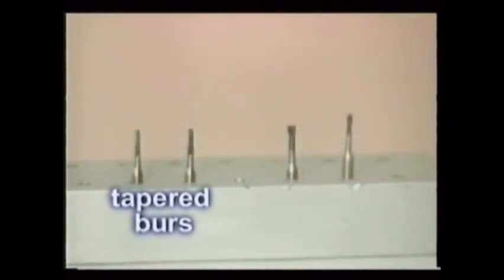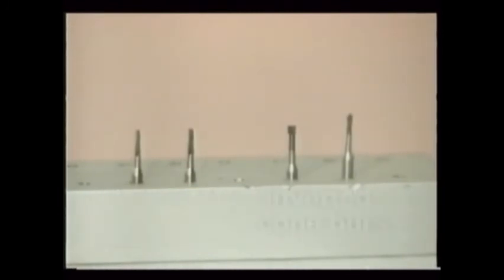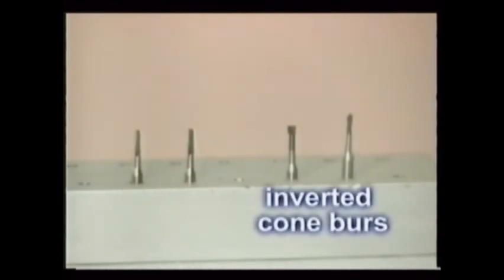Shown on the left here are tapered burrs. These leave diverging walls that have proper tapers for setting indirect restorations into place. The inverted burrs on the right create converging walls. These help lock the amalgam fillings into place.